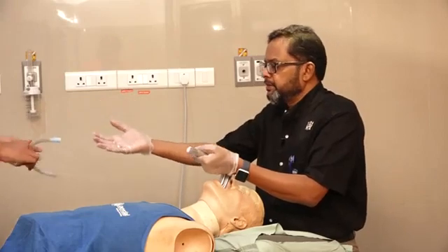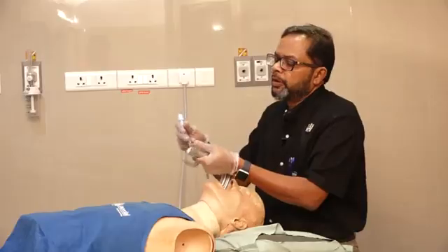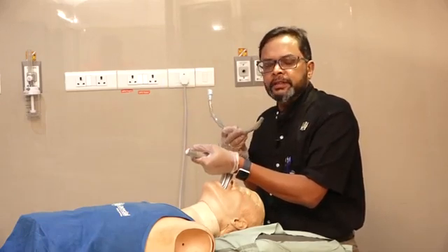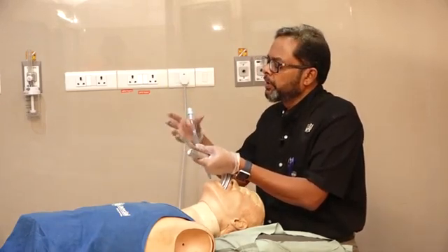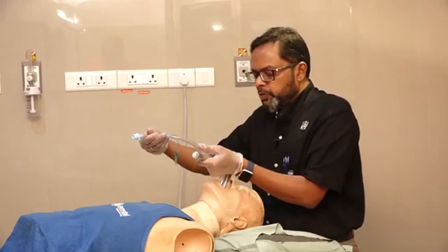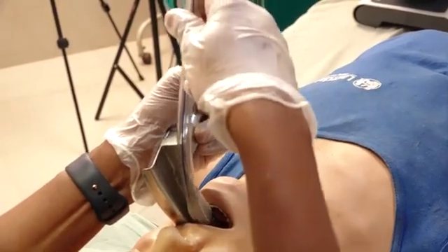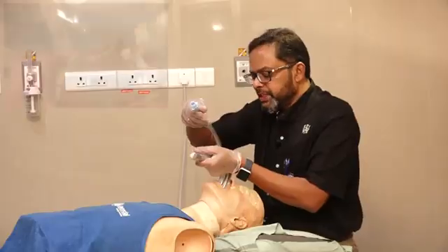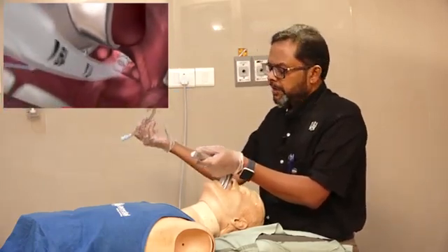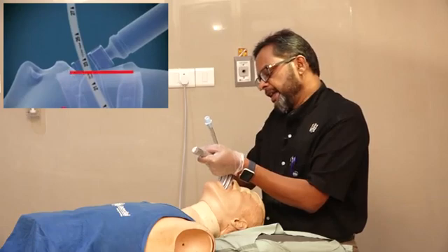When you get the endotracheal tube, hold it correctly — don't hold it like this. Holding it incorrectly is the wrong technique because the contaminated part will go into the larynx. You should always hold it properly, then insert the endotracheal tube through the angle of the mouth. Many people introduce it through the channel of the laryngoscope, which is the wrong technique because it will obscure your view. You want to introduce from the right side and then advance gently into the larynx.